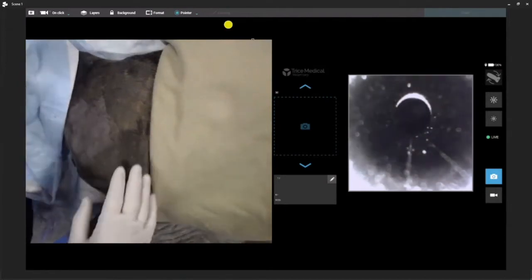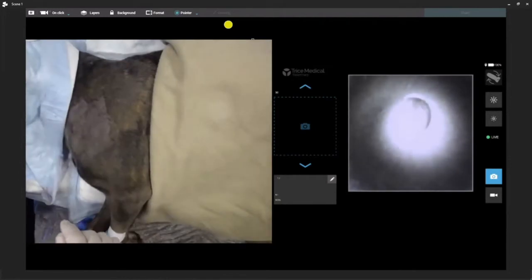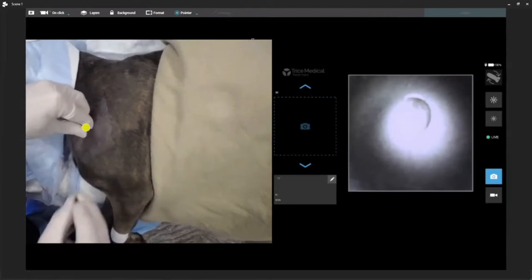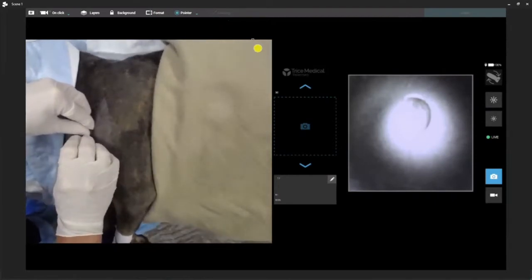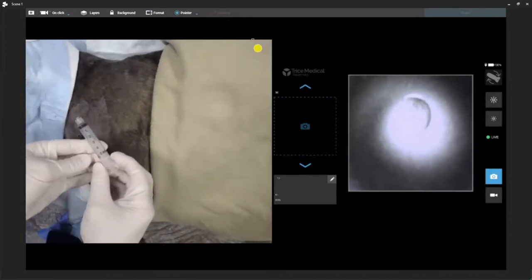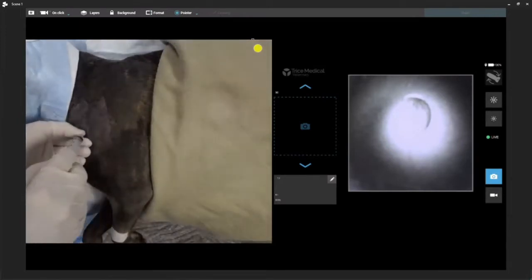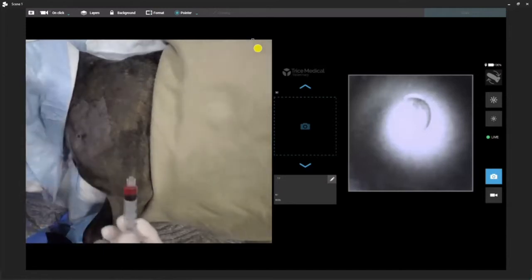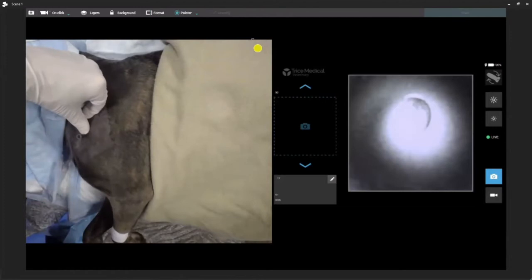We're right here at lateral recumbency. We're going to take our 22-gauge needle — standard scope portals. Here's the acromion process — finding the scapula of your acromion process. We'll slide the needle directly off the acromion process. I use a 22-gauge needle with a 1.5-inch length. This is a 5 or 6cc syringe, just something small so you can aspirate — that tells you 100% that you're in the joint. You can see our flash right there. That tells us 100% we're in. If you don't see that flash, you're most likely not in — pull your needle out and redirect.